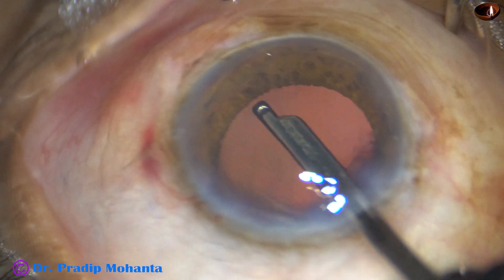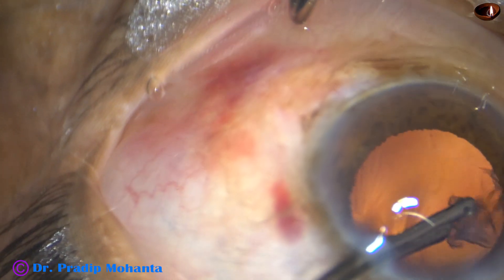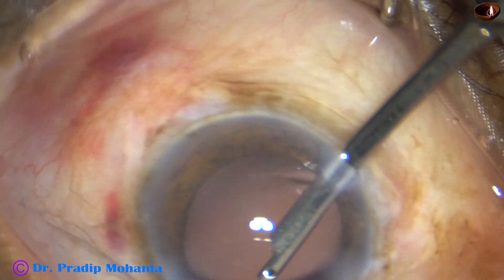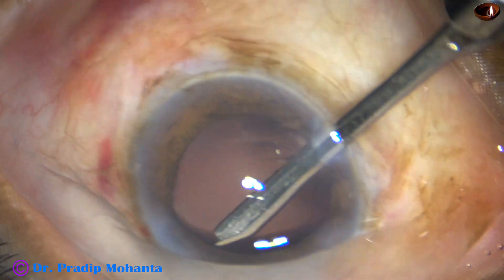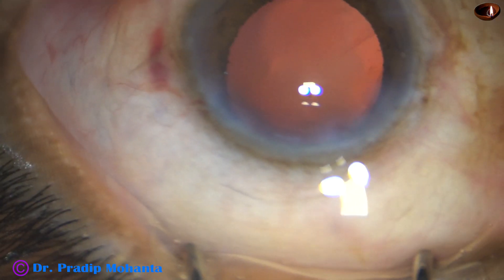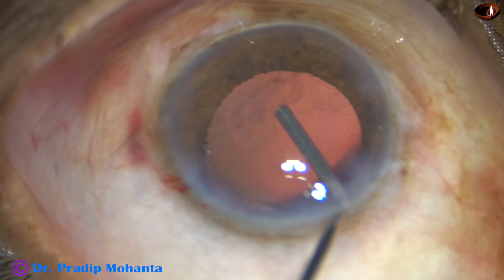Very little cortical matter remains in this case — some fibres are there. Just sub-incisionally, some more fibres are present and those are removed. I go through the right side port where there are some more fibres at around one o'clock, and those fibres are removed as well.